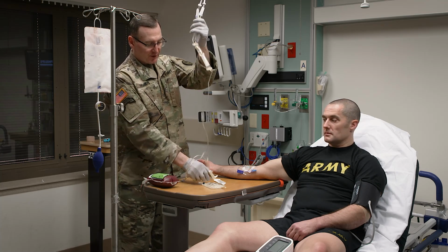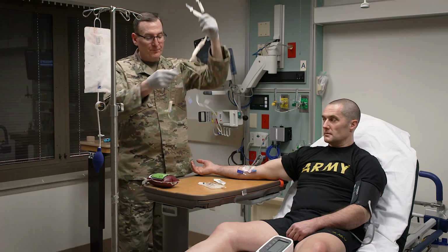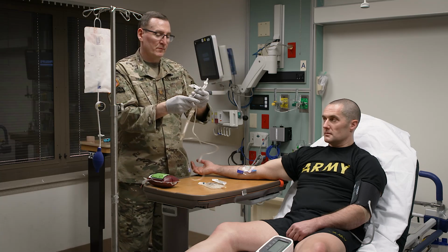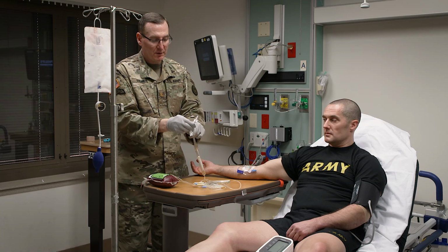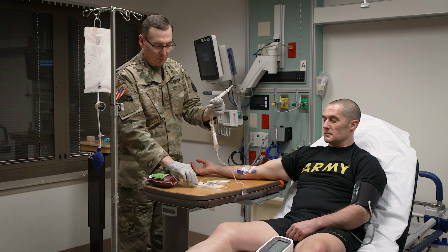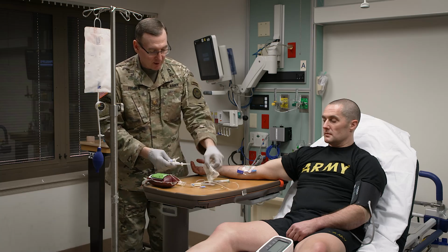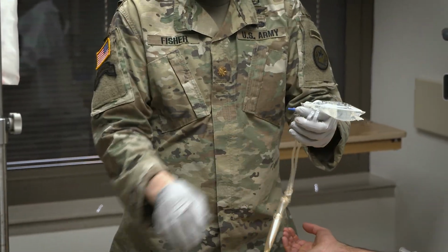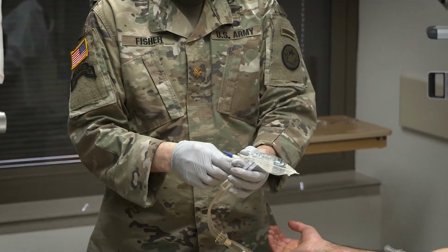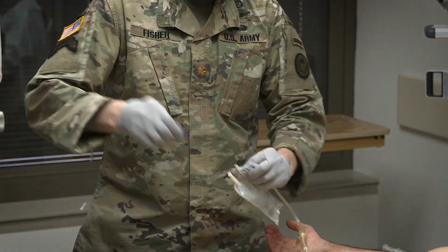First thing you're going to do is make sure that all your clamps are closed. So you have a total of 3 clamps on this one, one below like you would have on a normal IV set, and then you have the 2 above that are for your blood and for your saline. Go ahead and spike your saline.